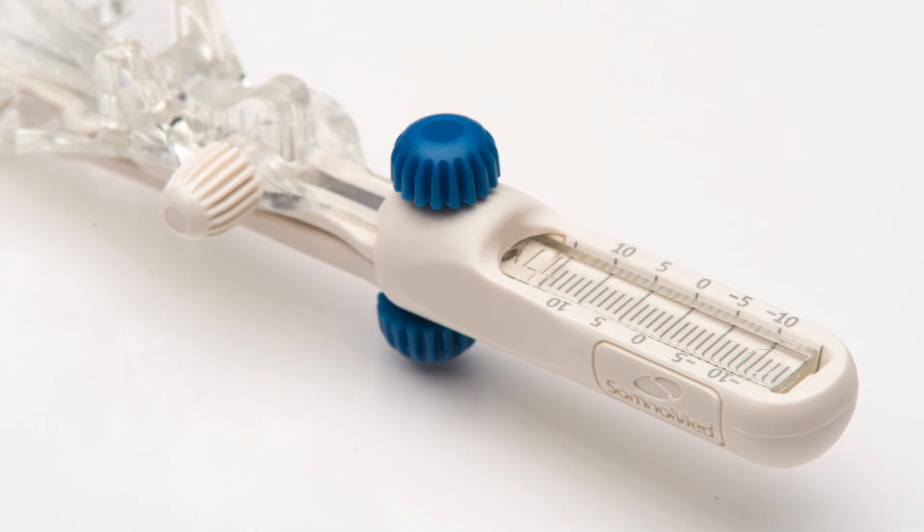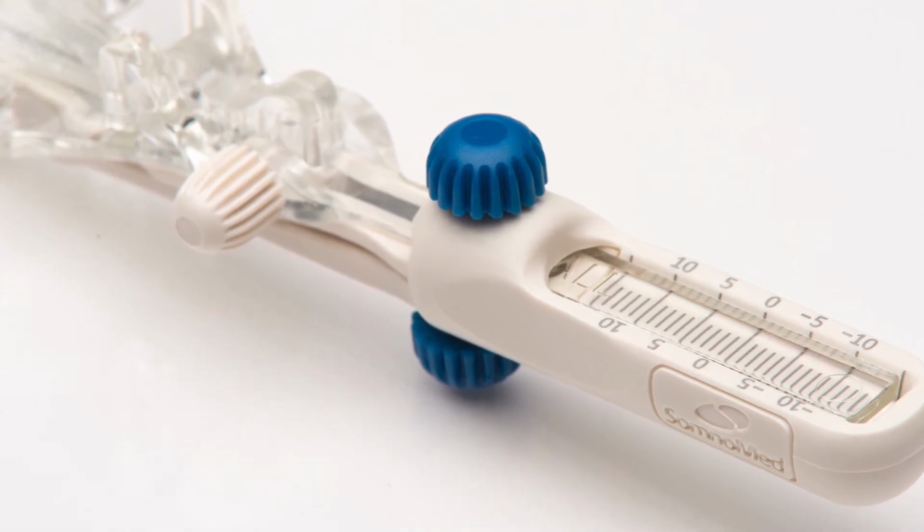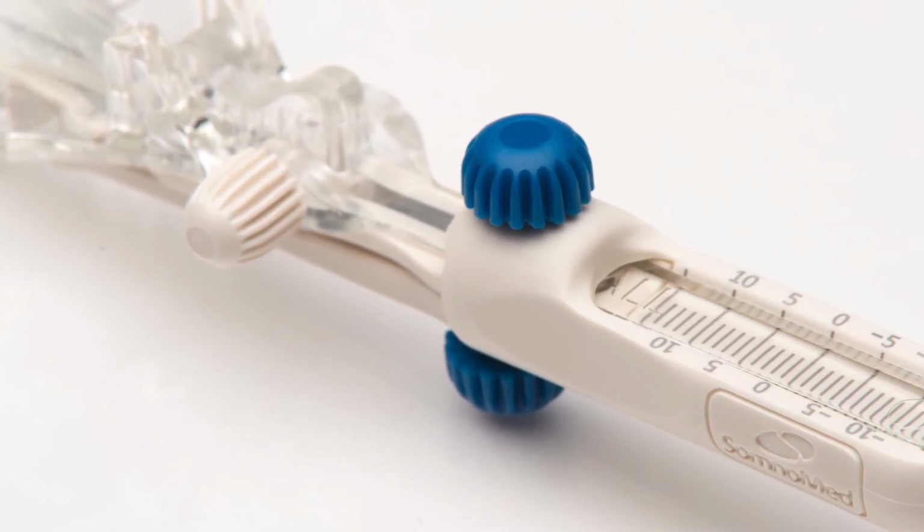The handle, slider, and upper and lower screws can be cleaned in an autoclave after use.